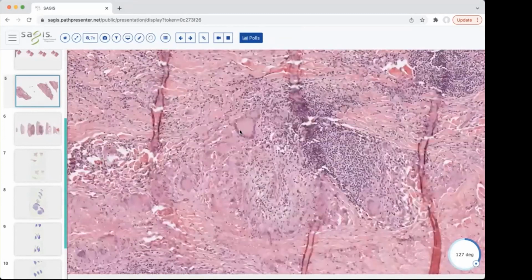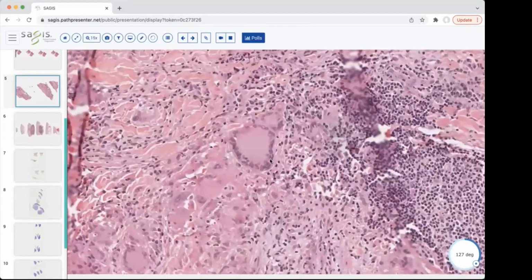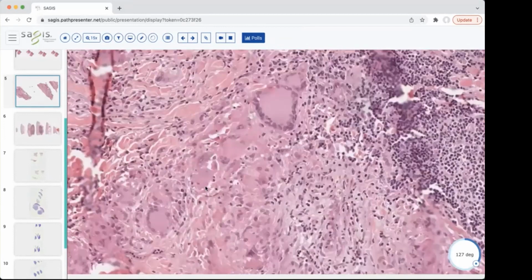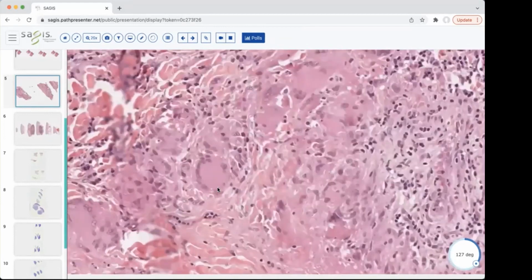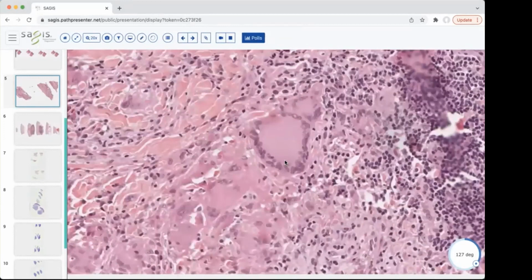We like to name the giant cells often in dermpath and in pathology. This is the giant cell that has the wreath of nuclei, with foamy, bubbly cytoplasm. Often the periphery outside of these nuclei will be even a little more foamy. But this is a Touton giant cell, which is commonly described in this entity.